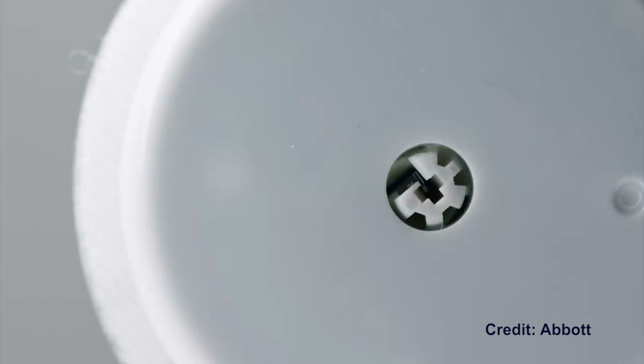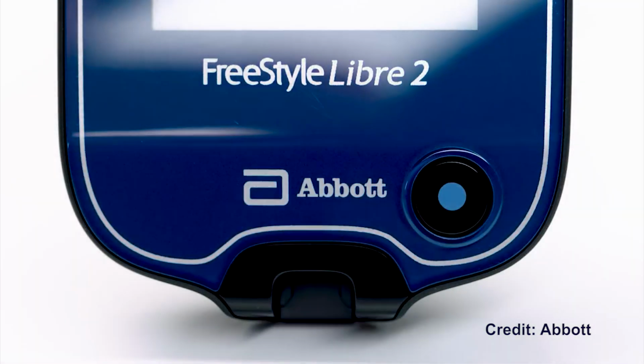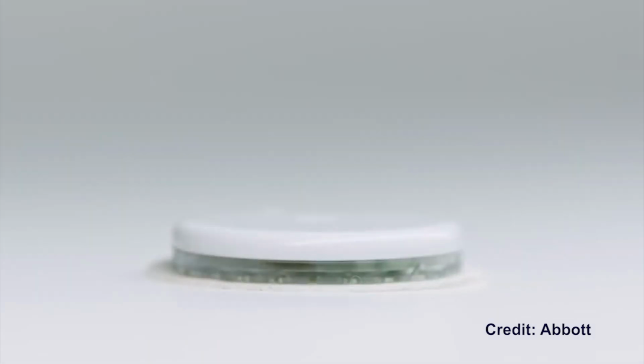In a press release, Abbott stated that FreeStyle Libre 2 is designed to digitally connect and communicate with other devices. So Libre 2 can be used in the digital decision support tools environment, and we already have loads of apps that take CGM data and combined food intake, exercise, etc. to help you make better dosing decisions when you're on MDI or a pump. So it can be used in that kind of environment, but not in a closed loop system.